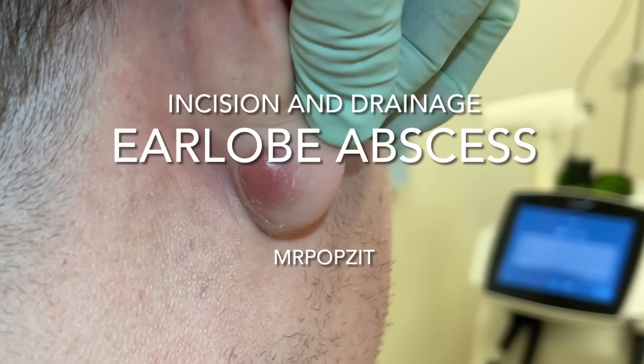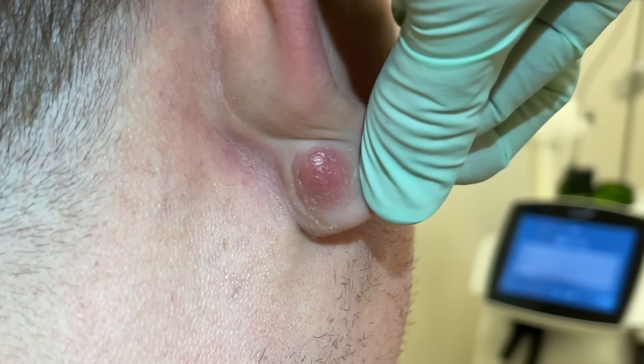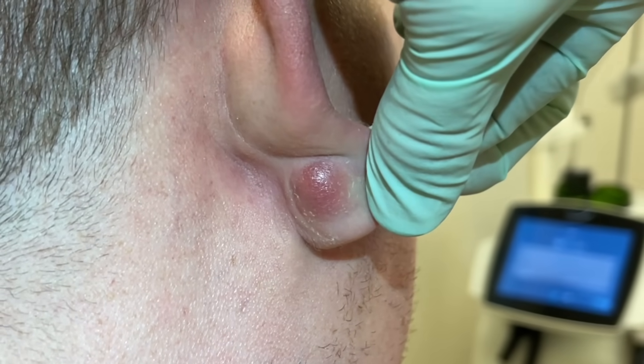Hey guys, here we have MrPopZit, Greg Lindstrom PA here. We have a cyst that is in the earlobe and just recently it got inflamed.